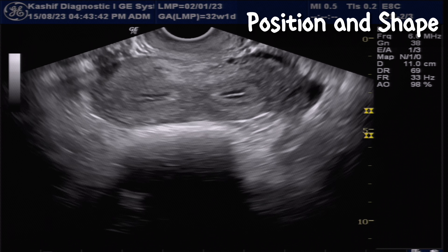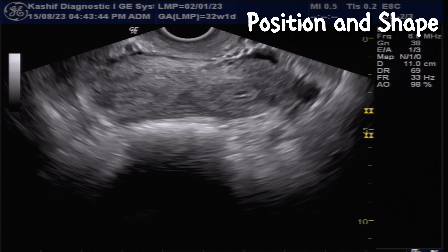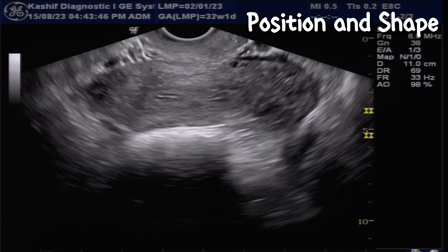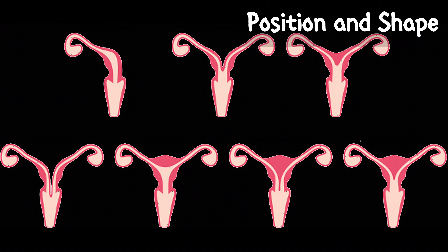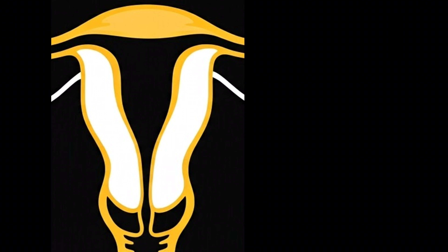Other positions like retroverted and retroflexed can also be detected, but they usually don't affect fertility. Abnormal shapes of the uterus can also be detected by ultrasound. The most common abnormalities are bicornuate, septate, and didelphys uteri. These conditions can sometimes cause complications and increase the risk of miscarriages.